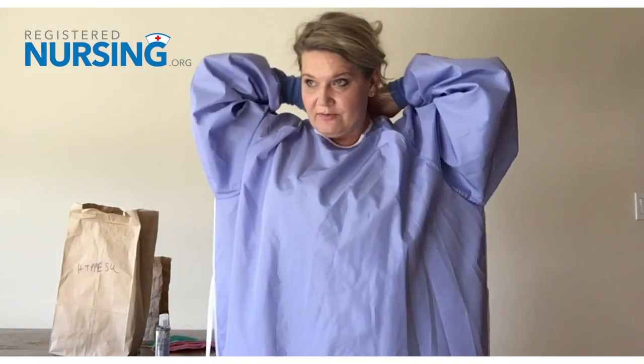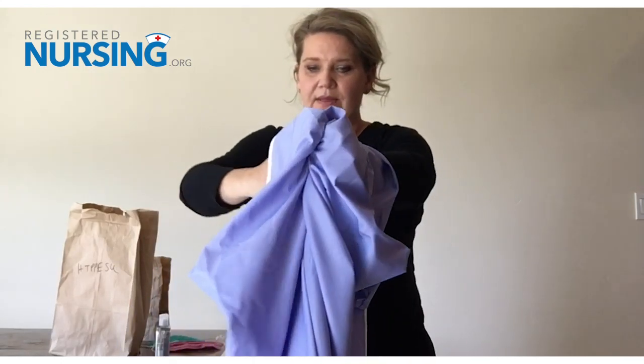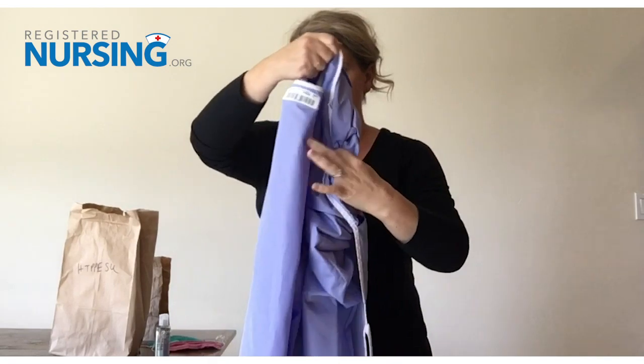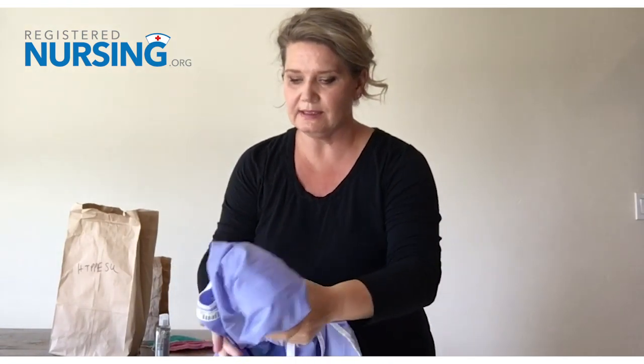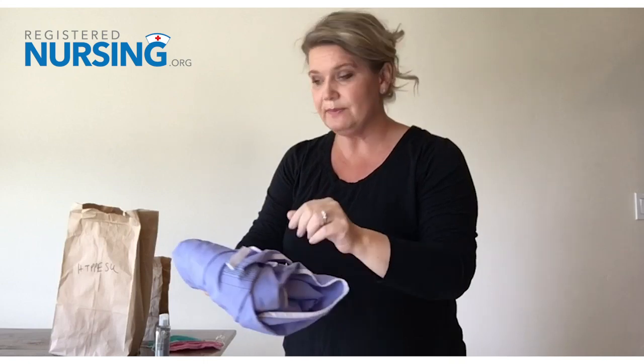Now I'm going to take off my gown so I can reuse it. Typically we'd start at the shoulders and pull down, rolling it — but we're reusing this gown and it's minimally exposed, so I'm actually going to start at the sleeves and work my way down, holding it away from me and rolling it into itself, then back into my bag. If you're able in your area to hang your PPE, that is just as good — the CDC recommends both methods: hanging your PPE or putting it into the paper bag.